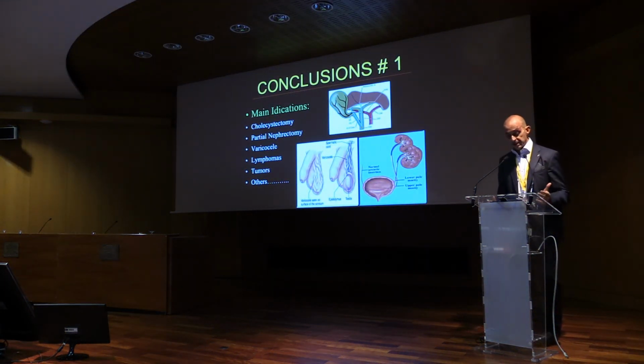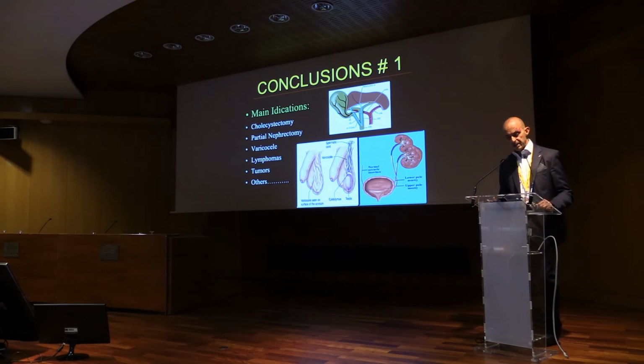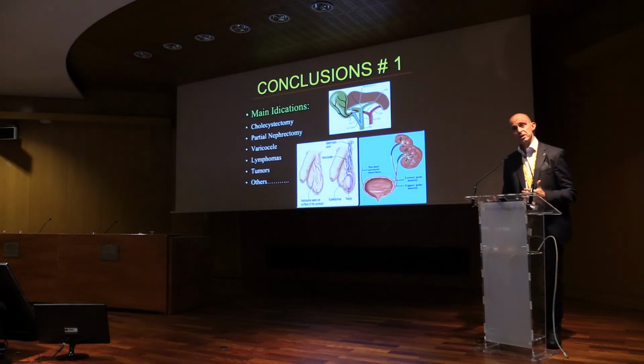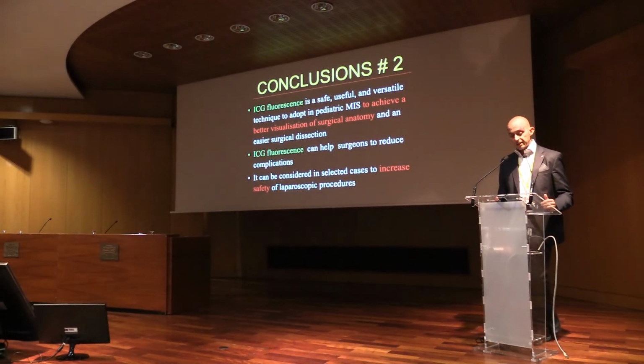For sure, cholecystectomy, partial nephrectomy, varicocele, but also tumors or gynecomastia, as I showed in my experience. I think for cholecystectomy, varicocele, partial nephrectomy it is mandatory because surgery is easier thanks to ICG. Next. And for sure, I think that ICG fluorescence is a safe, useful, and versatile technique.